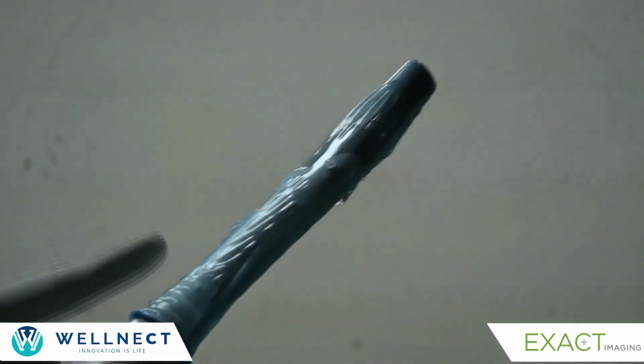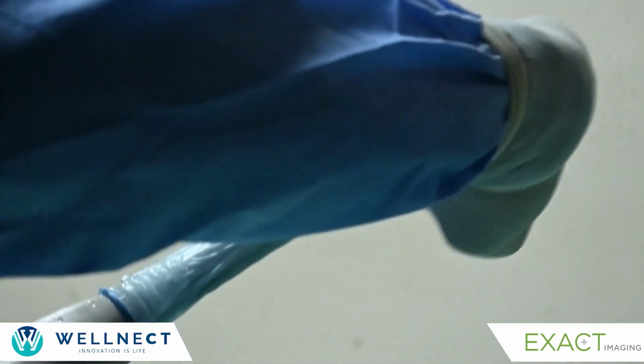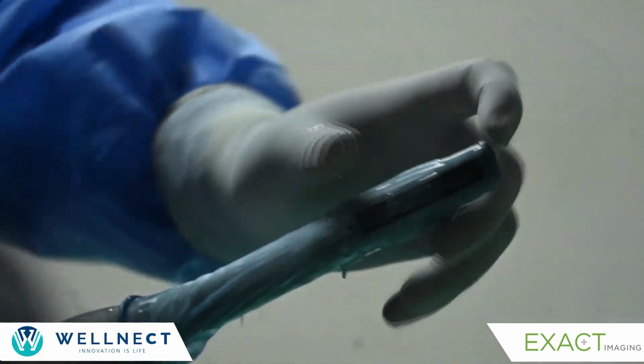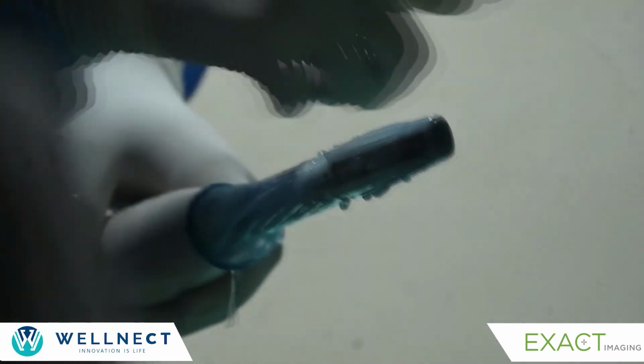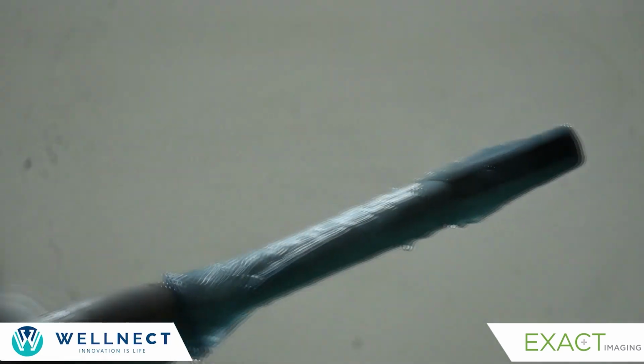You have to understand, if it is side firing, that means this is the probe, this is the prostate. So the probe looks at the prostate and takes the biopsy from the side of the prostate. But if you have to do an end firing, then the other probe will have an array over here. So this is the prostate, you look at the apex, and with that you get an end-firing biopsy. I am going to show only a side-firing biopsy.